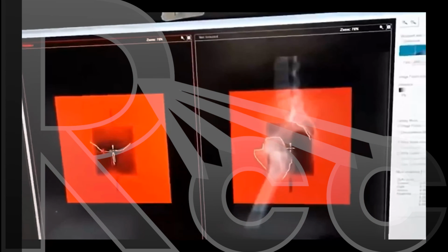So in the pelvis here, we see those bony landmarks very nicely. In maybe a breast case, we're going to draw the chest wall or something like that. We also identify the graticule, and a lot of this work is done up front. And when we overlay the lines on our treatment image, we're able to align the border and perform the image match using those lines that we've drawn.